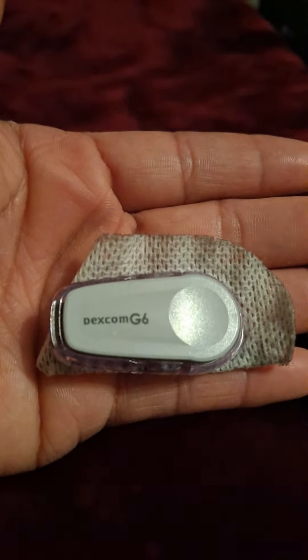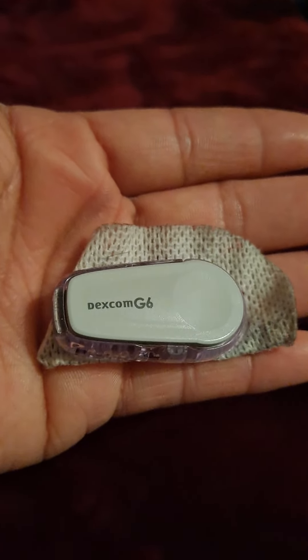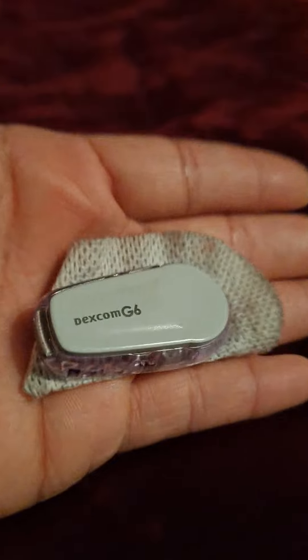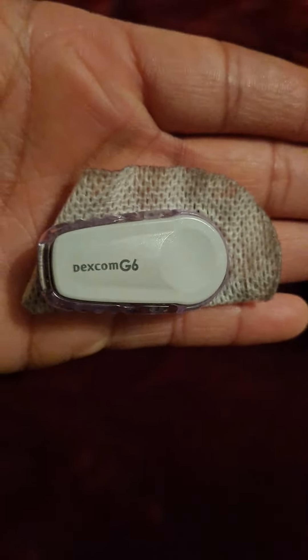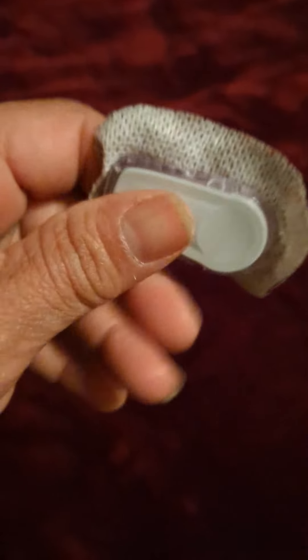When you first take the sensor off of the arm, or wherever you have your Dexcom placed on your body, you're going to peel off the sticker — preferably with some coconut oil or something — and then you peel it off and the whole thing comes off.